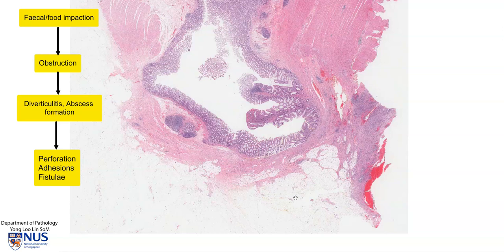Hence, we only have some thin connective tissue, some subserosal tissue, and this is at risk of perforation. In the event of perforation, there may be adhesions to adjacent structures within the abdominal cavity or bowel loops. And there can even be fistula formation to adjacent loops of bowel, and this is a complication of diverticular disease and diverticulitis.